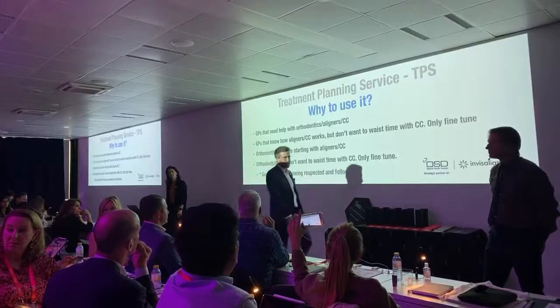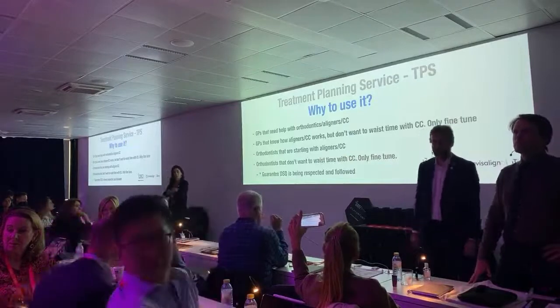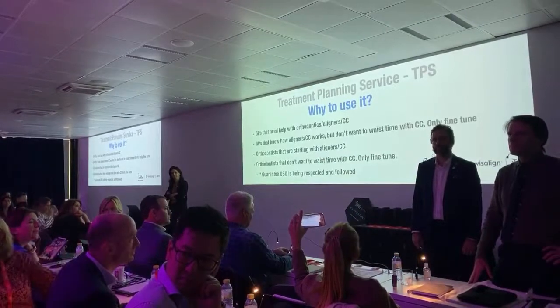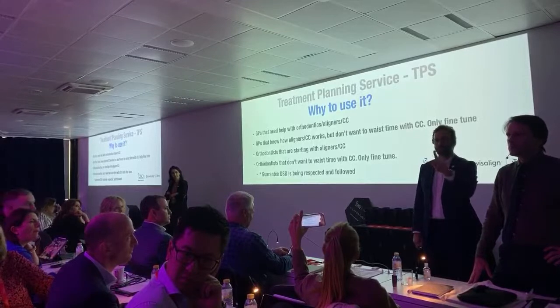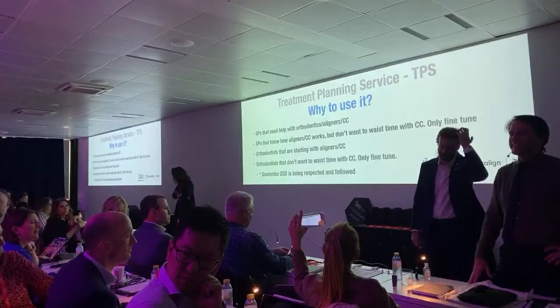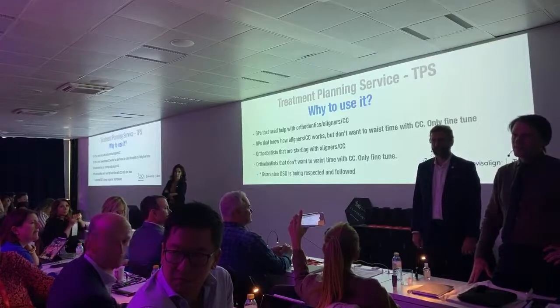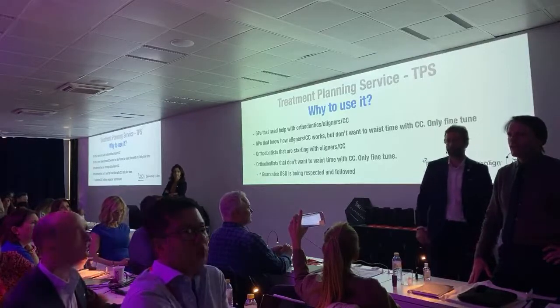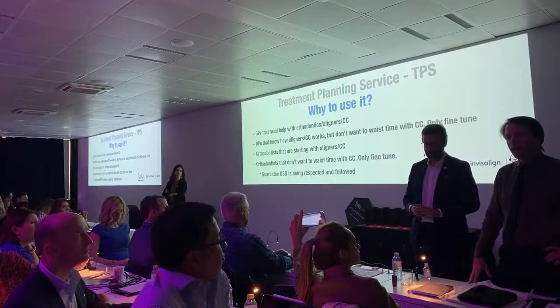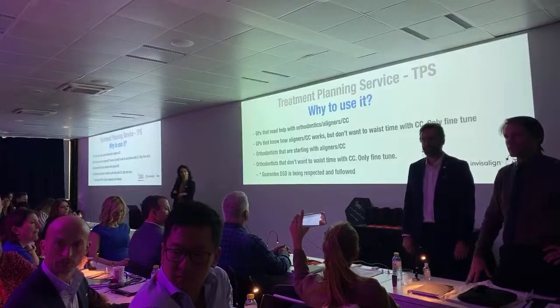I didn't quite understand the idea. I was doing a DSD collaboration case, and along with that came the orthodontic simulation in Nemo, which I used to do a mock-up for the patient. But the mock-up doesn't go over the ortho simulation. It's the smile design over the ortho simulation, the ideal design, adapted to the actual situation of the patient. But you can use that as a mock-up. Yes, you still have this.